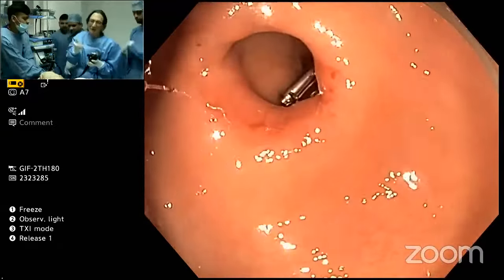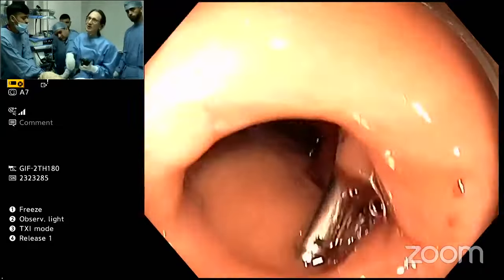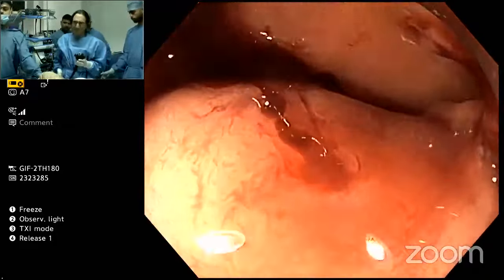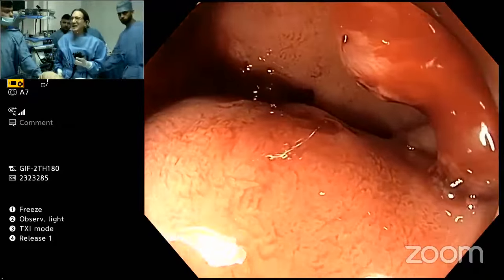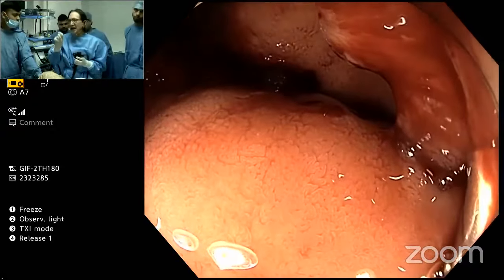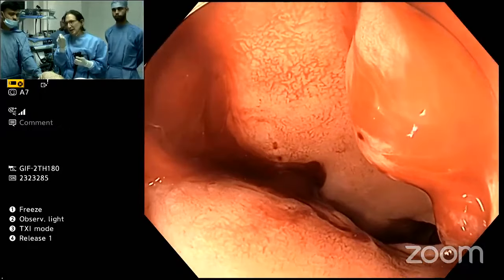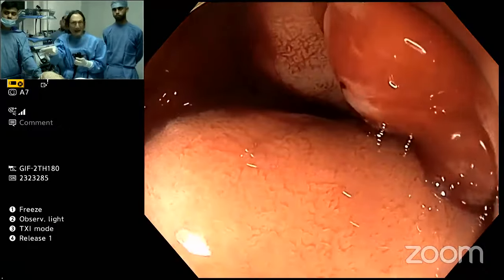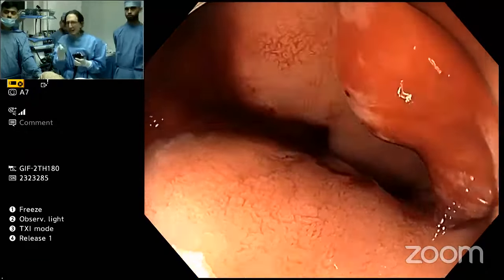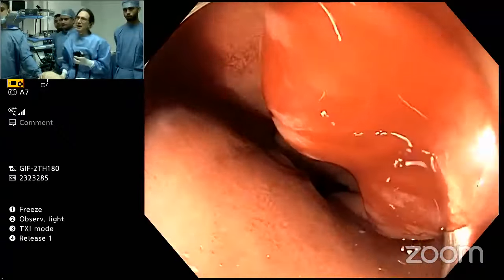So when you're sharply angulated with your scope, you have to realize things are more difficult. The reason why I know this so well is our biggest struggle back in the Axios development days with X-Lumina. Every time we had the echo endoscope very angulated, we had all sorts of problems with our sheath, and the Axios would start to deploy prematurely when we're pushing against resistance. That's why it's so important never to push against resistance when you're doing an Axios procedure.